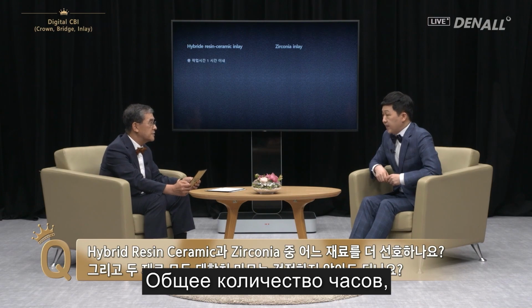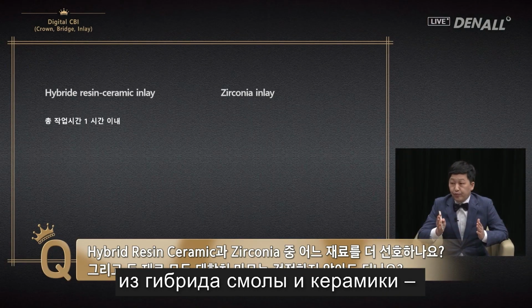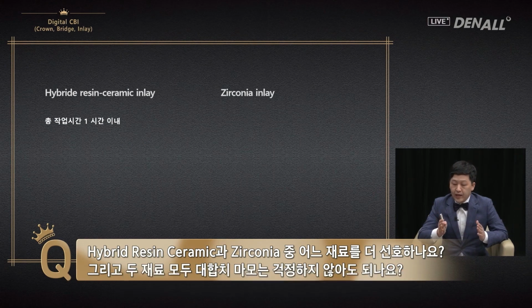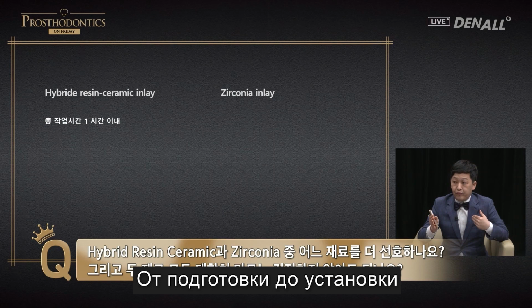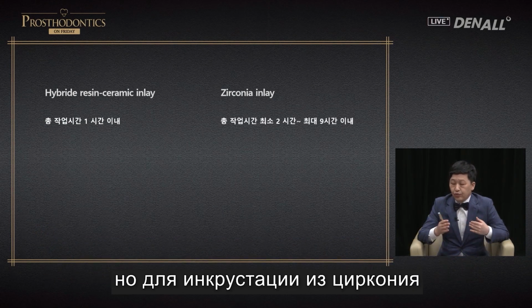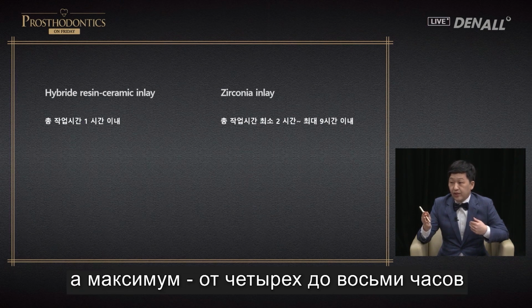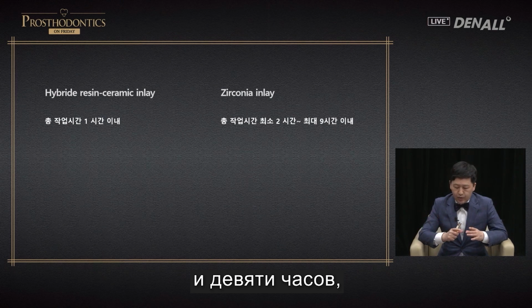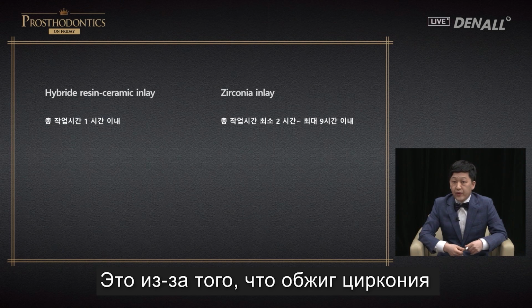The total amount of time required for a hybrid resin ceramic inlay is approximately 1 hour or 1 hour 10 minutes at the most. From prep to setting, it takes that much time. But for a zirconia inlay, it takes at least 2 hours, and at maximum it takes 4 to 8 hours, and 9 hours if cooling time is taken into account. This is because it takes time to fire zirconia.